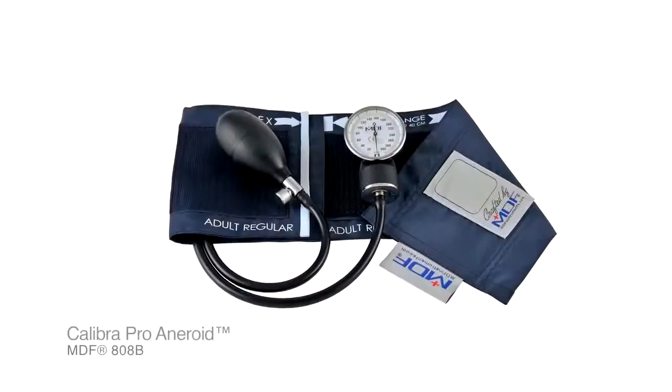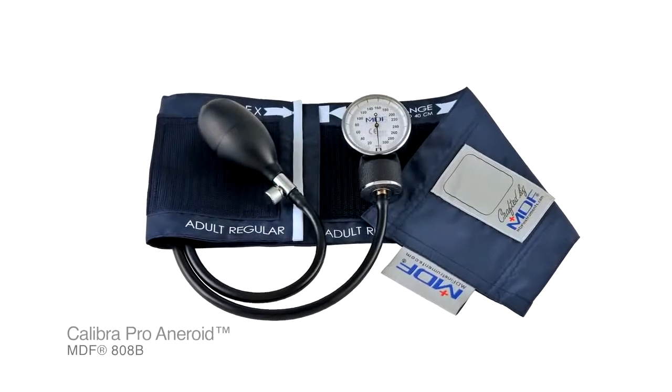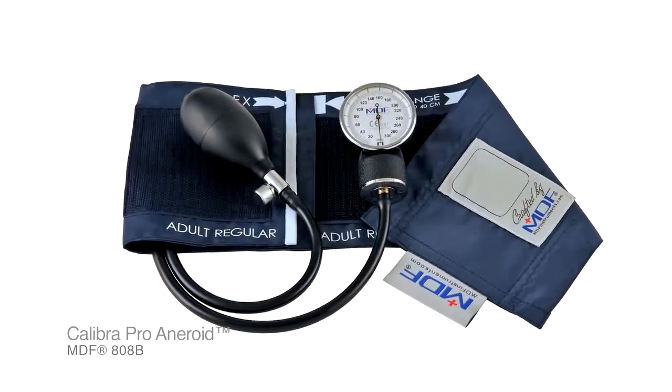The MDF Calibra Pro aneroid sphygmomanometer, more commonly known as the pocket aneroid, is a handheld portable blood pressure measurement device that's really designed for medical professionals in all settings.